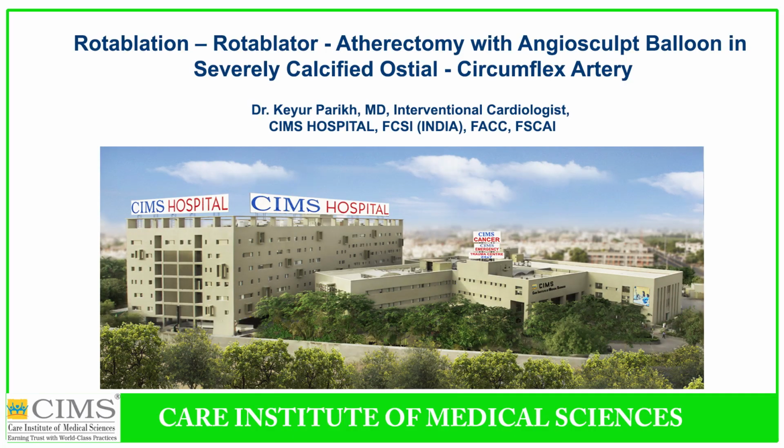Dear colleagues, I am Dr. Keyur Parikh, Senior Cardiologist at CIMS Hospital, Ahmedabad. This is a case of an elderly gentleman who had a severely calcified ostial-circumflex artery, for which we did a combination of rotablator and angiosculpt balloon.